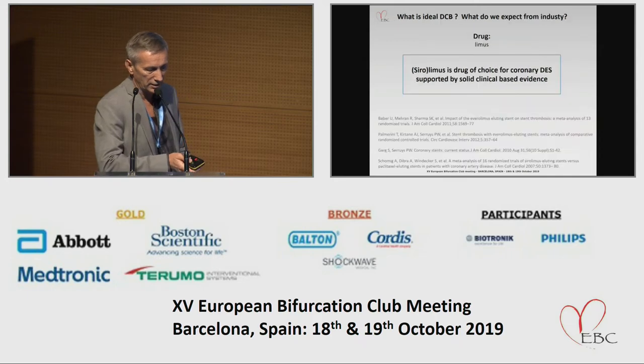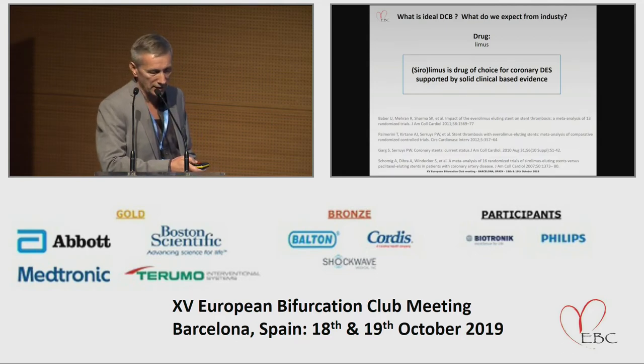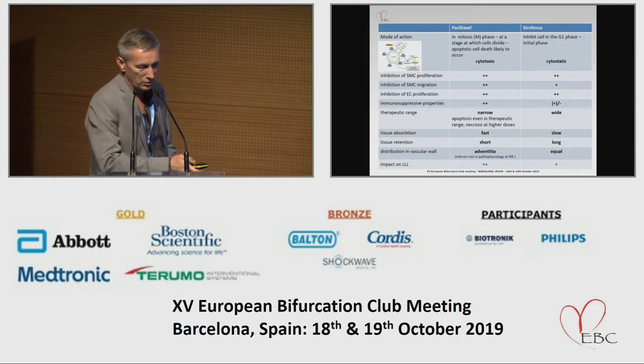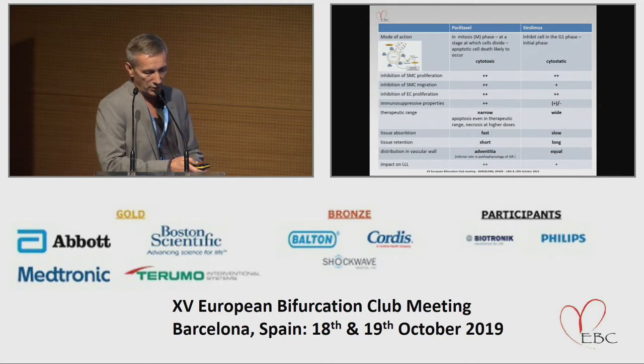Another thing to discuss is the drug. There is solid clinical evidence for the drug-eluting stent that sirolimus is better than paclitaxel, but we don't know if it is true for drug-coating balloons. The mode of action is completely different. Paclitaxel is cytotoxic because it works in mitosis, where the cell divides, and cell death, apoptosis, is likely to occur even at a therapeutic dose. So the therapeutic range is narrow for paclitaxel, and the opposite is true for sirolimus. They do the same job with smooth muscle cell proliferation and migration and endothelial cell proliferation, but tissue absorption is fast and retention short for paclitaxel, just the opposite for sirolimus.